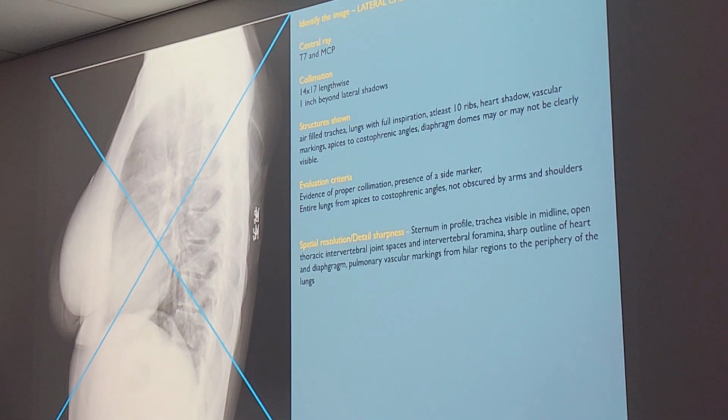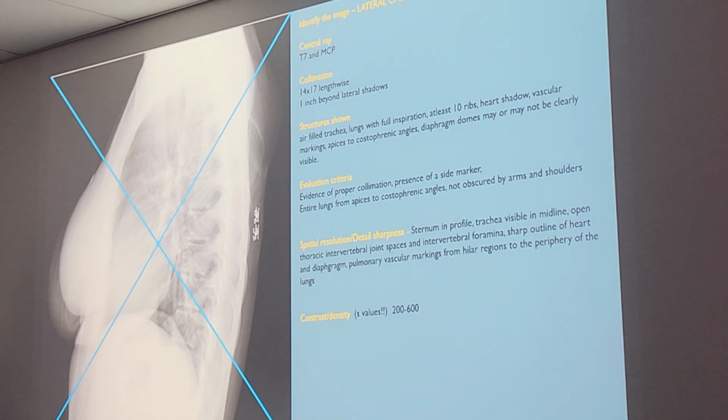Is that the marker, ma'am? No, that is actually an artifact. What is it? A tattoo. The back of the bra. It's the snap. Remember, there's the metal hooks. It's not a tattoo. Tattoos don't show up like this.